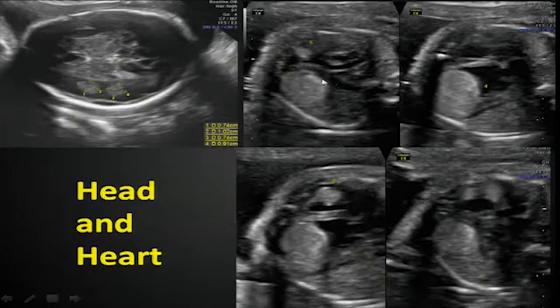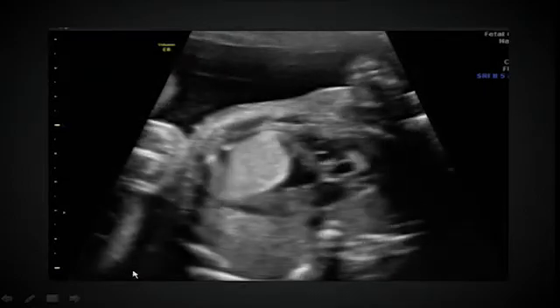Once you see that, we start looking around trying to find out what part of the heart these different areas are at. We try to label them. And then we want to make sure we look at the brain, the liver, the spleen, and the kidneys. Because if you see these little masses in the heart, you can also find them in other places in the baby. So looking at the head and the heart, and then in real time again.